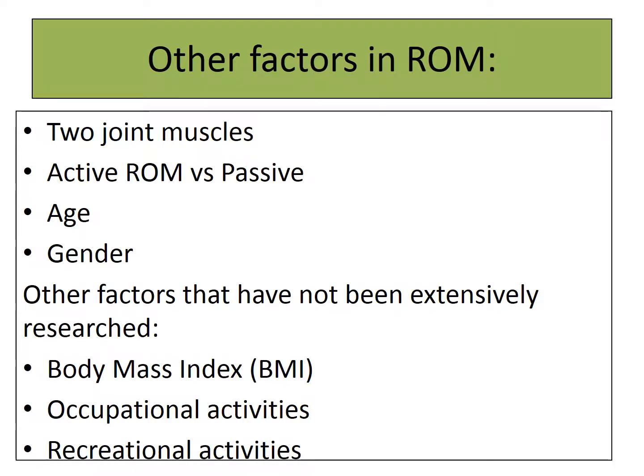So when you are measuring hip or knee motion, it's going to be very important on positioning so that you take out the extra stress that is caused on that muscle, or the tension on that muscle if it is being stretched at both ends. So there's a difference. Since the hamstring will extend the hip and flex the knee, if we are measuring hip flexion, right, that's going to put the stress on the hamstring. If we are measuring hip flexion, we have to allow the knee to flex so we take the tension off.